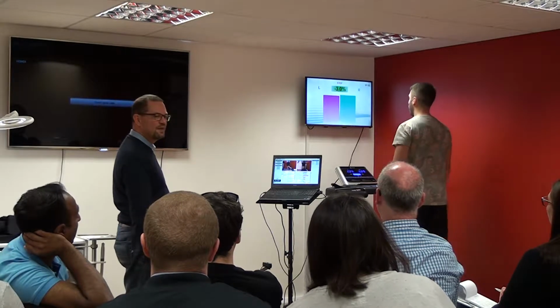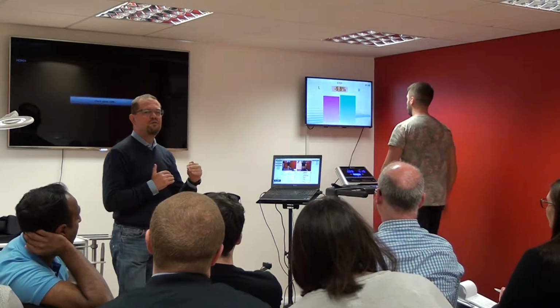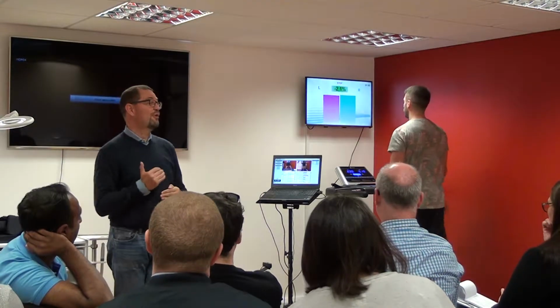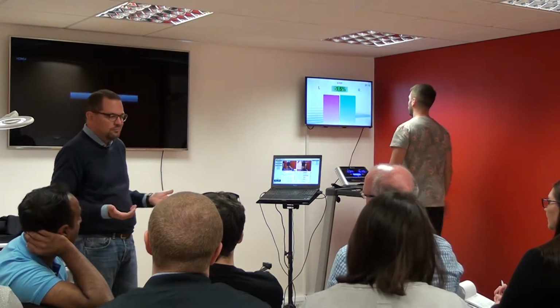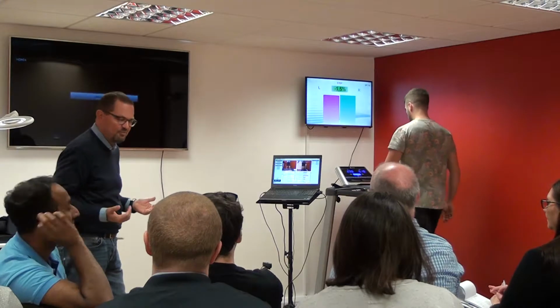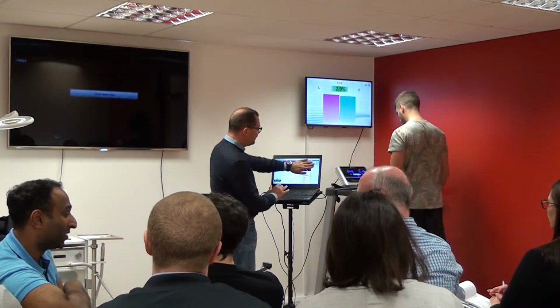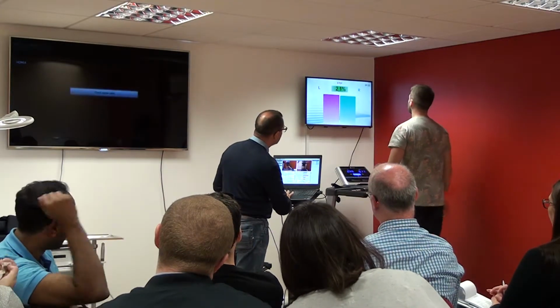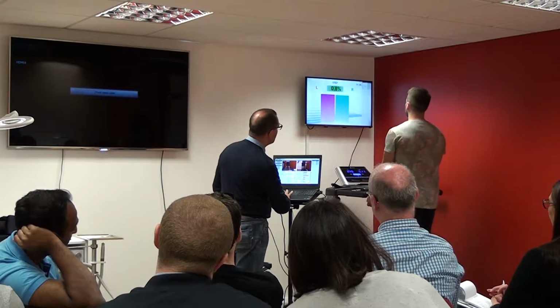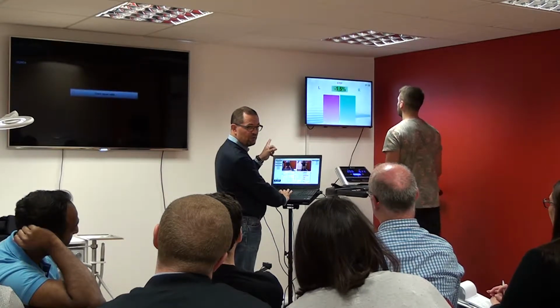Alright? So of course, now if we put 5%, we can do something more challenging. Say, okay, I want 3%, or I have a patient with problems, let's go to 10%, 15% is acceptable. So here, essentially I can choose what I want to show on the second monitor.